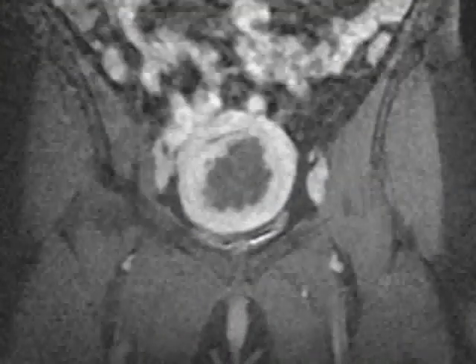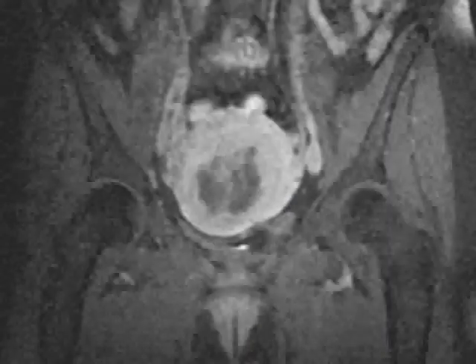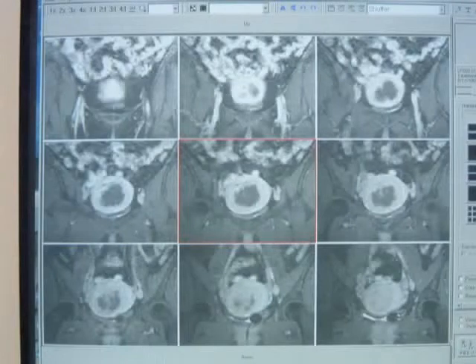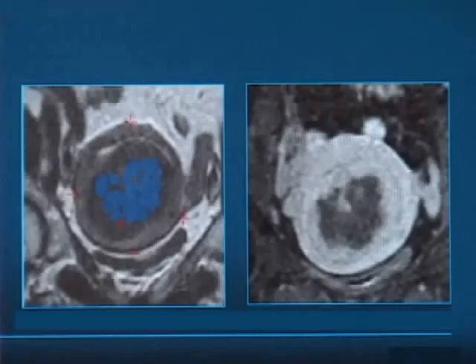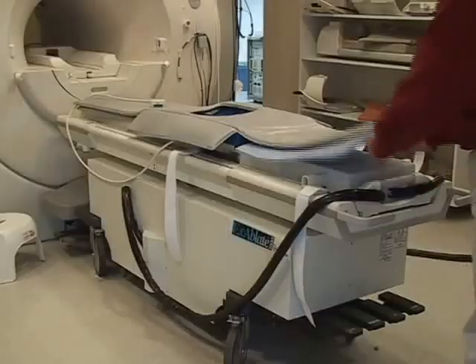Contrast-enhancing agents distinguish uterine fibroids from healthy tissue. These post-treatment contrast-enhanced MR images enable the physician to verify the immediate treatment effects by depicting the coagulated region caused by the ablation process. The ablated tissue is slowly resorbed by the body. This is an example of an accumulated dose map and the non-perfused volume at the end of a treatment.